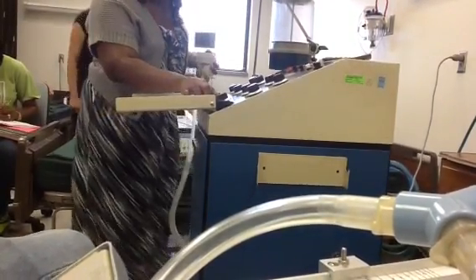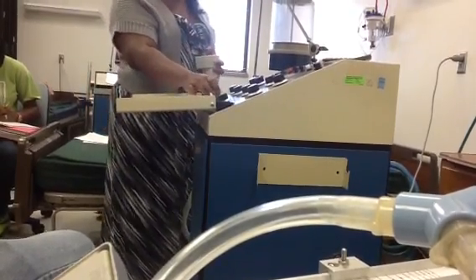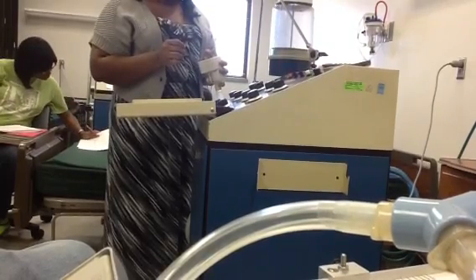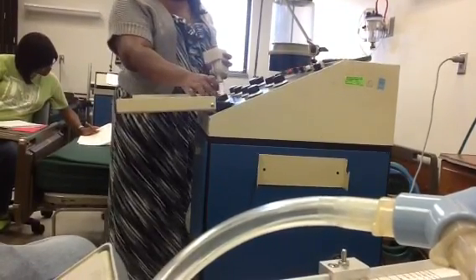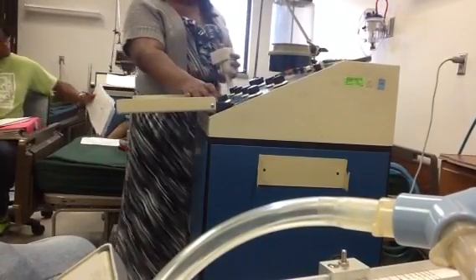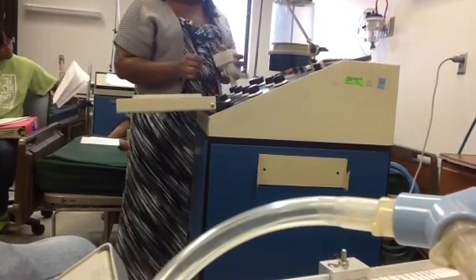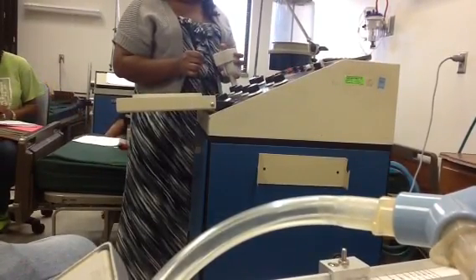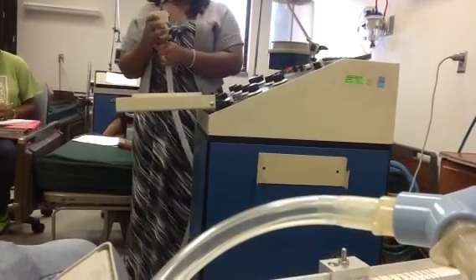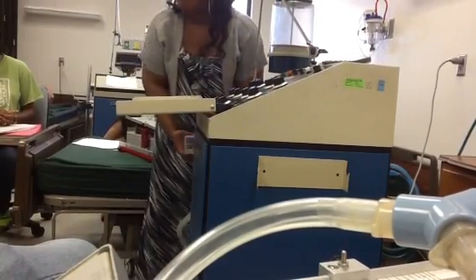So, I'll hit the normal button. And now I hold it, and that's better. Where's the normal? Is that F? J. So, on a normal breath it is 390.